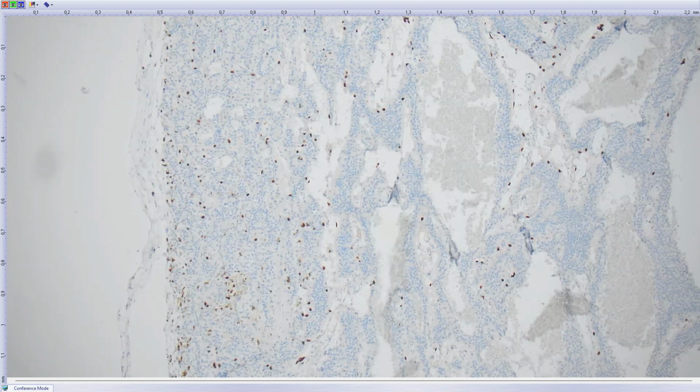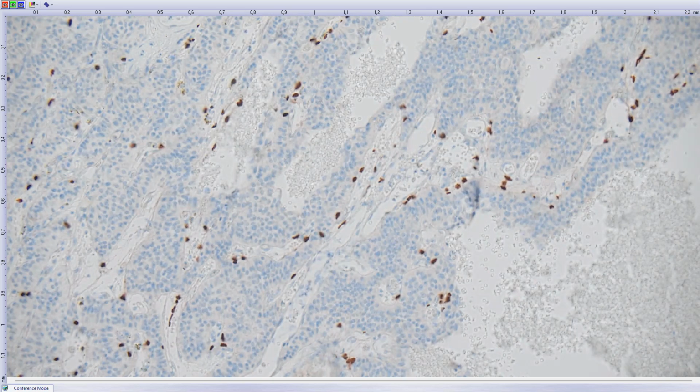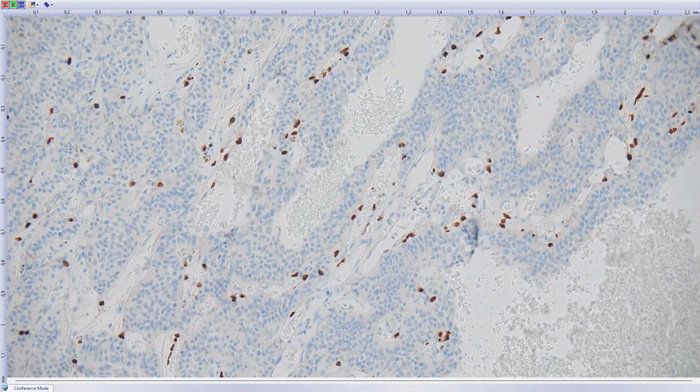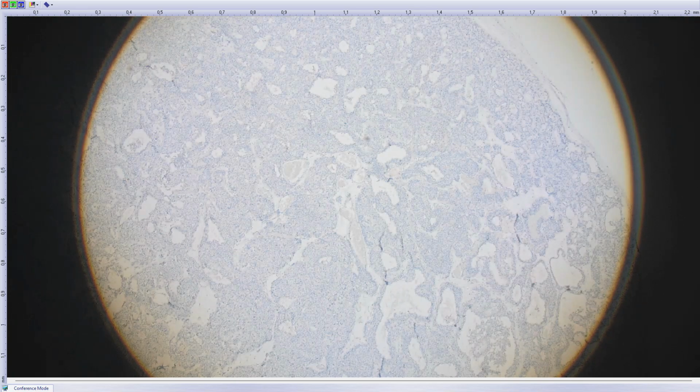By staining SOX10 or S100 protein, you will have this peculiar staining pattern. These are sustentacular cells. So the phenotype is like paraganglioma, but GATA3, which is positive in all paragangliomas, is clearly negative.